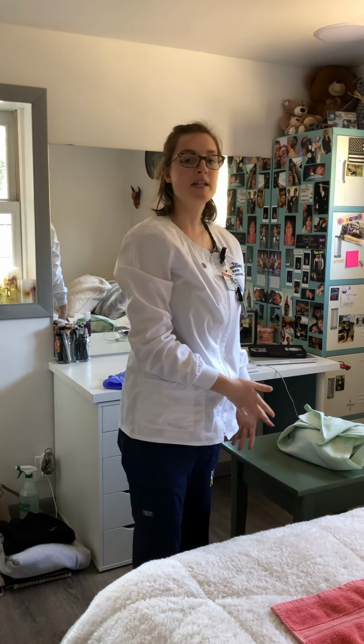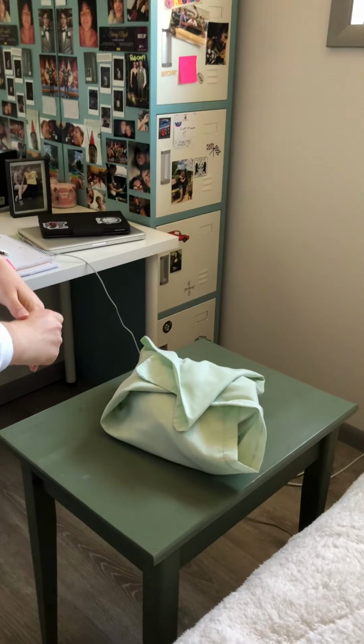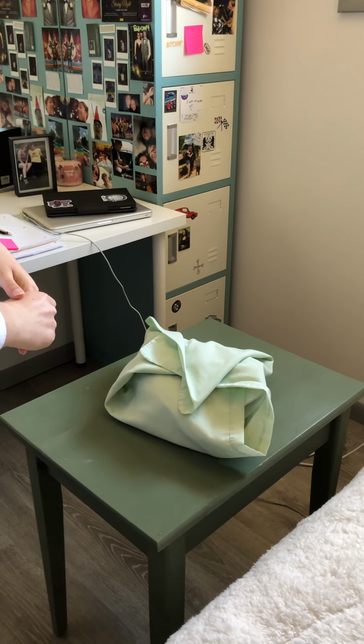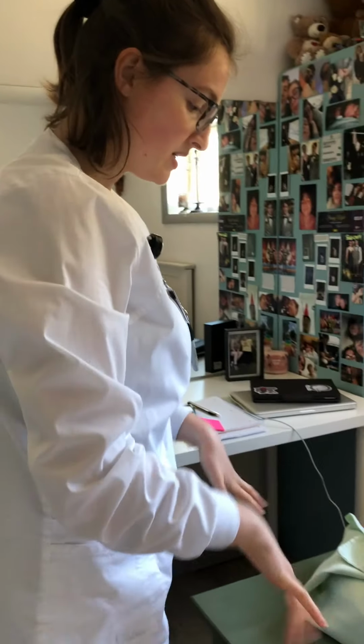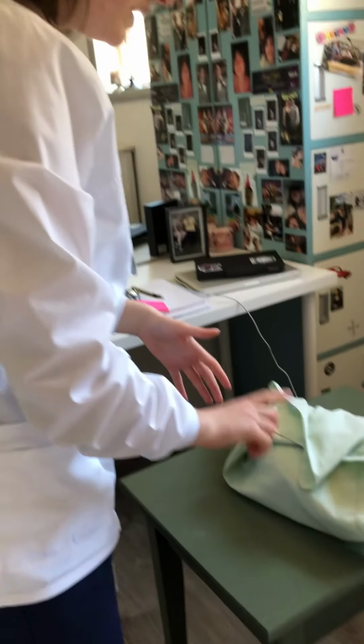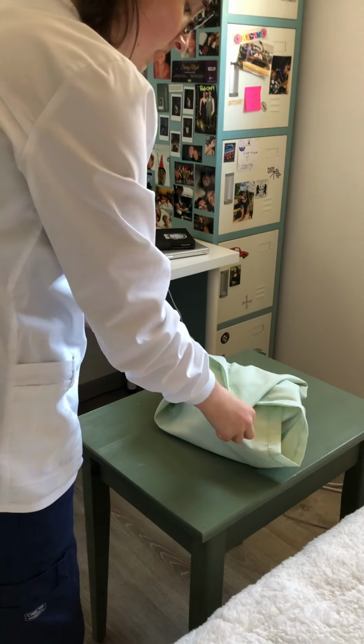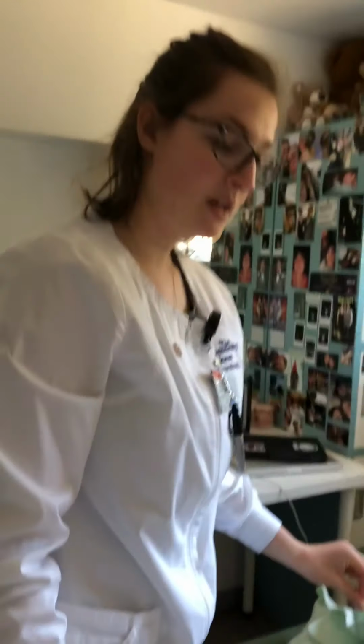So then at the clean bedside table, I have gone ahead and put the sterile kit here. I also forgot to mention, because I am right-handed, I'm standing on the patient's right side, but if I were left-handed, I would stand on the patient's left side. So I'm on the right side of the patient because I'm right-handed. So anyways, I have the sterile kit here, and what I want to do is open up the kit, open up the flaps away from me, okay? Using the corners, try not to contaminate that sterile field.